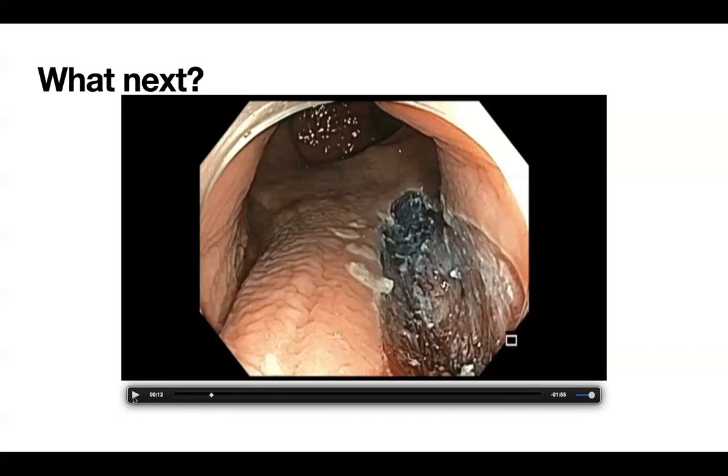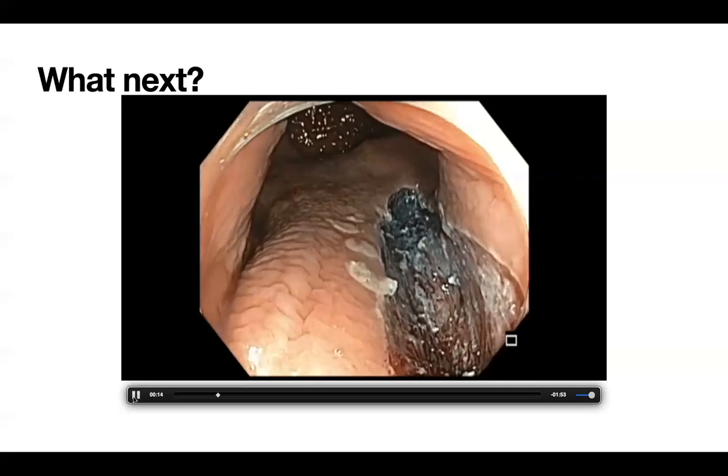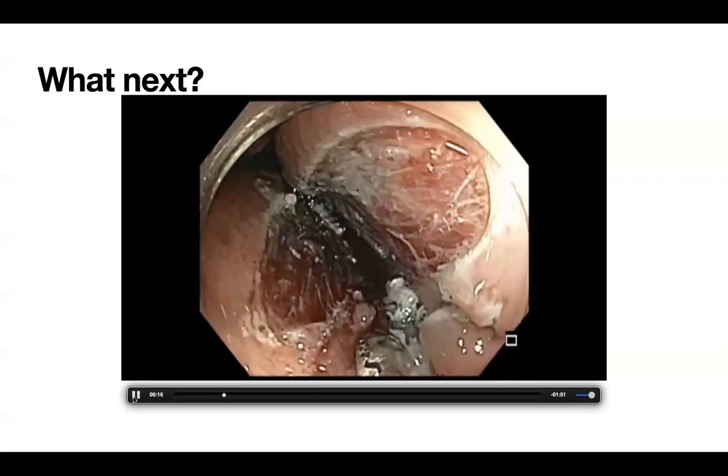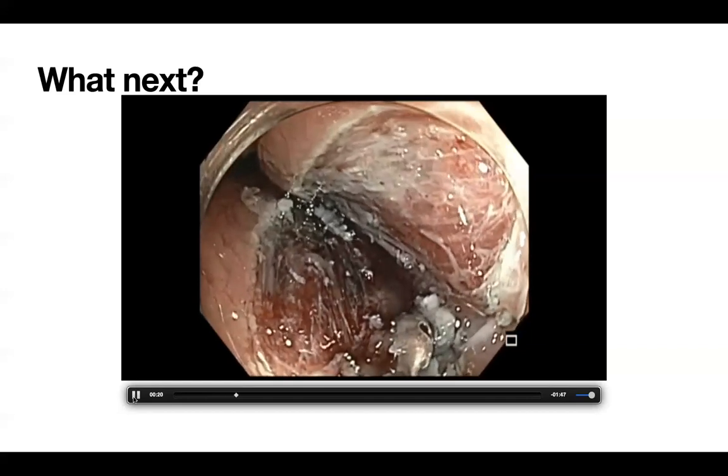And number two is that the resection is very much a small piecemeal resection, and there are possibilities of having bridges that are not cut into the submucosal level. So I would just rapidly APC it and be done.